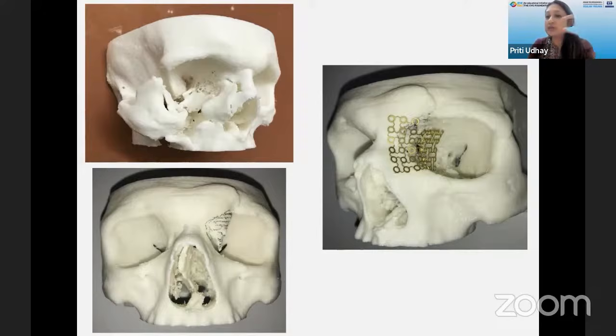So when you place the bone back, you don't know exactly where to place. The bone not only moves from lateral to medial side, but it also moves in this direction and it rotates. And this rotation is very important. Then only you will get this anterior projection in place. So for all these to be perfect, you need some kind of guidance during surgery or preoperatively.